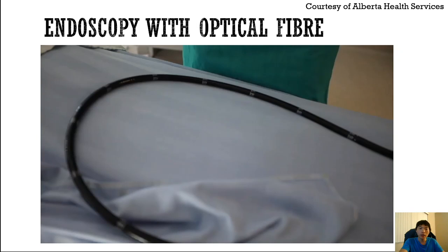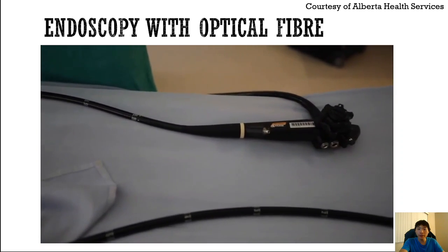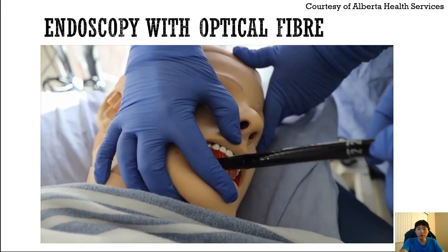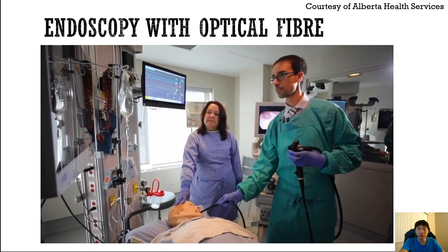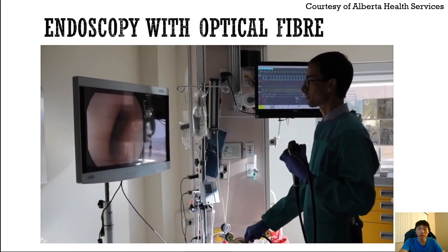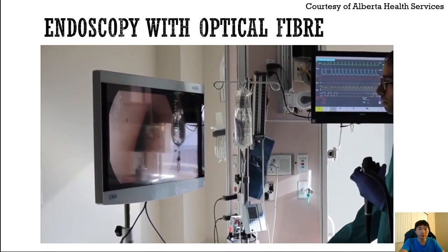So here, an endoscope is a long flexible tube. And it has a bright light and a fiber optic cable attached to a camera. And so here you can see the technician inserting the endoscope down the esophagus of this dummy that we use to train our medical students, but also our technologists.